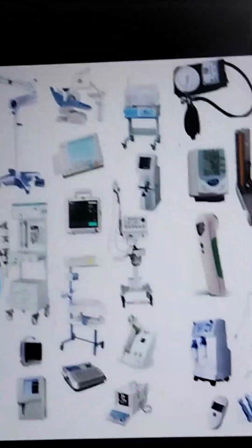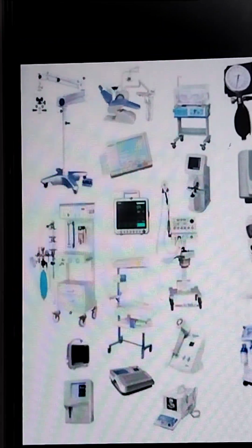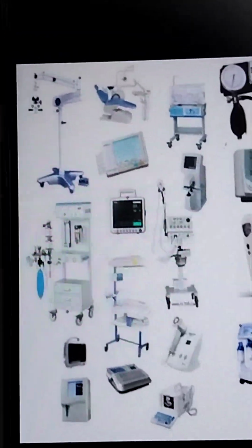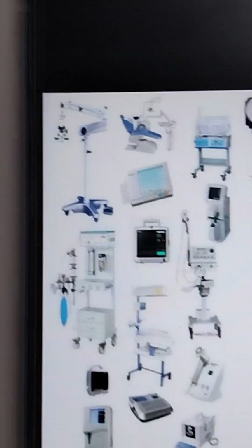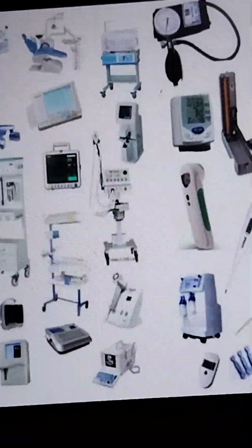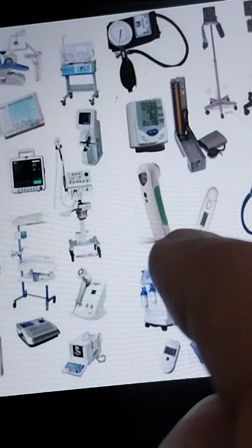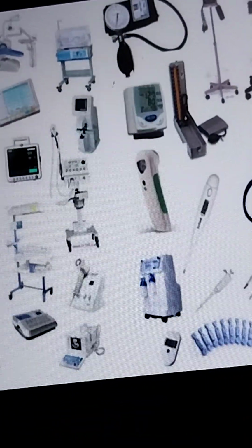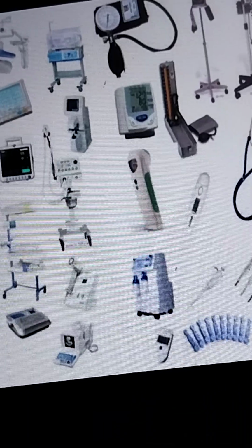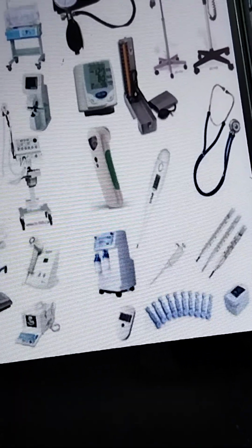1. Mechanical hazard. All types of electrical equipment can present mechanical hazards. These can range from insecure fittings of controls to loose fixings of wheels on equipment or trolleys.